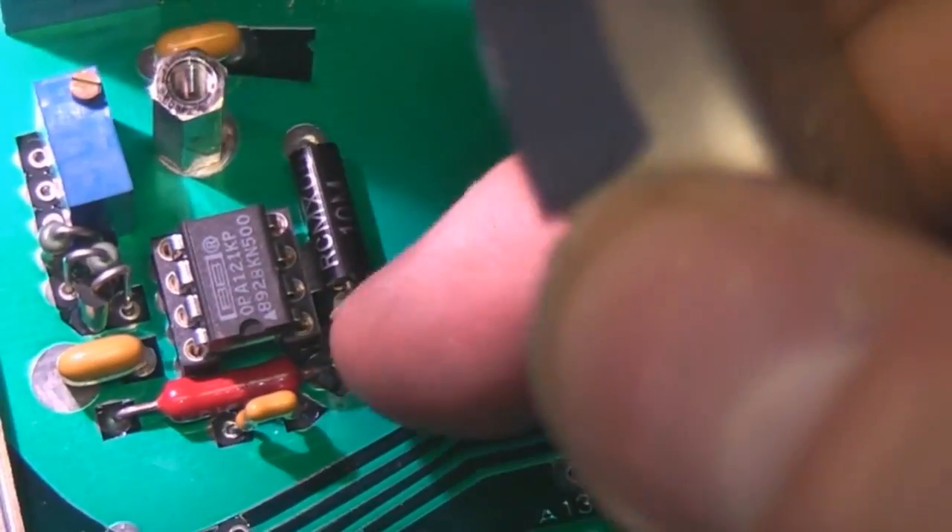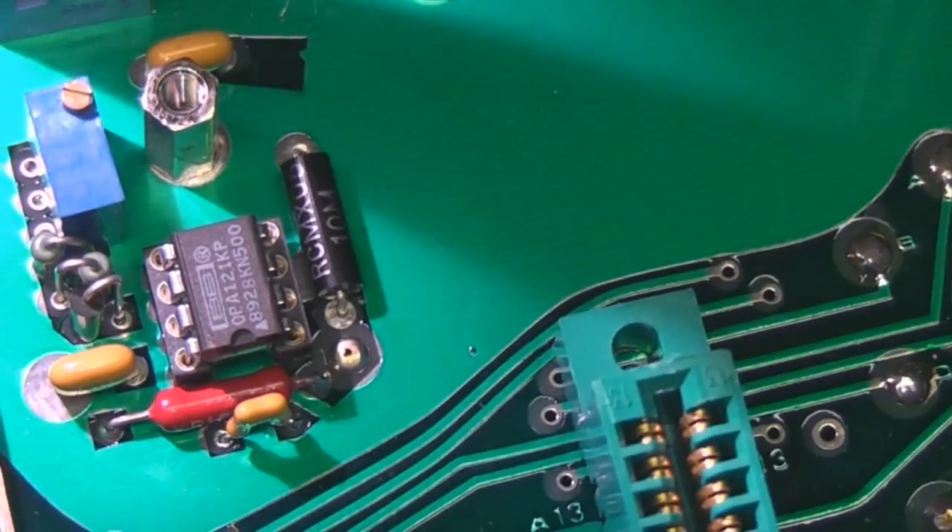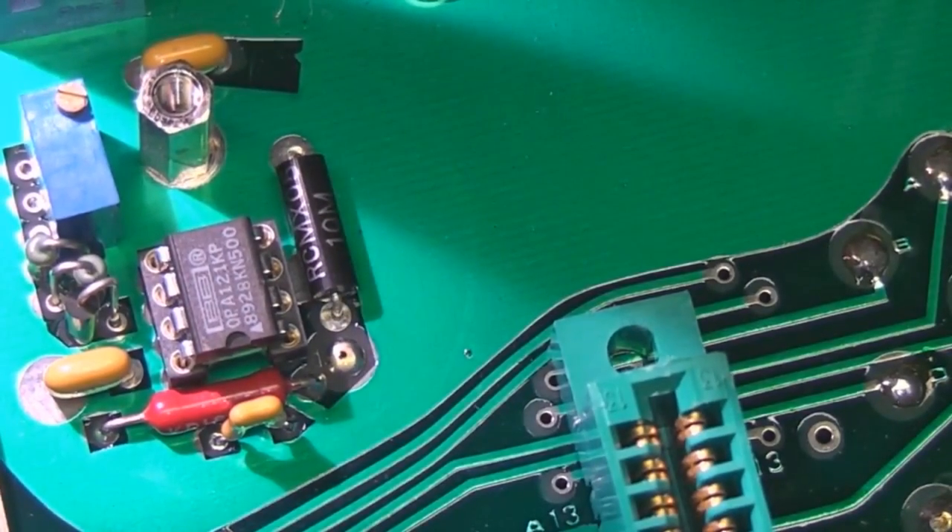It looks like they've actually used a different op-amp - this is an OPA121 which is different from the one in the schematic, so this could be a later version than that schematic.